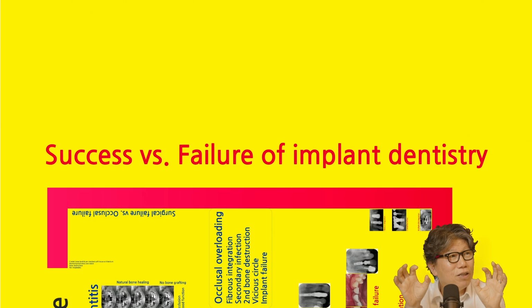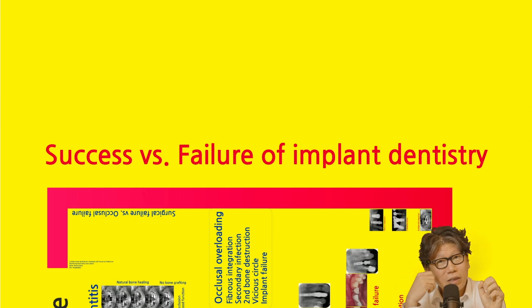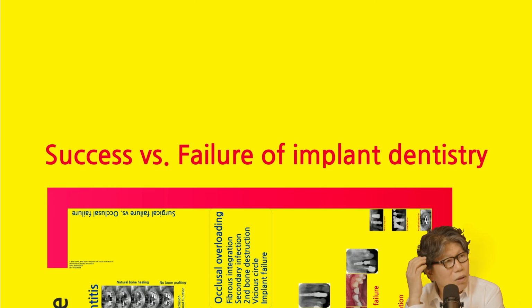I don't know which one is right, from my personal perspective. But if you do a long-term study in the Brånemark implant group, 10-year follow-up, the success rate in the maxilla is between 80% and 90%, and the mandible is in the low 90s. But the weird thing is, Korean domestic implants, they count like 99.7% of the time. So I don't know which one of these is true.